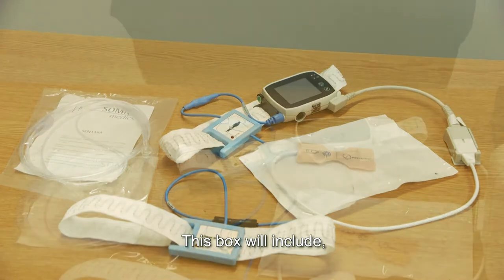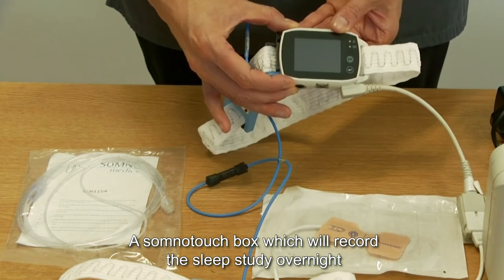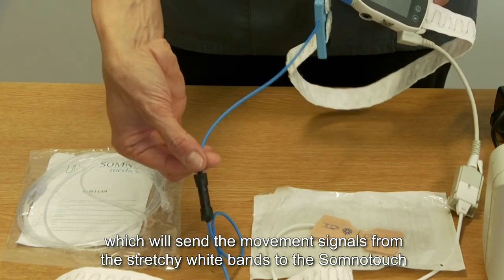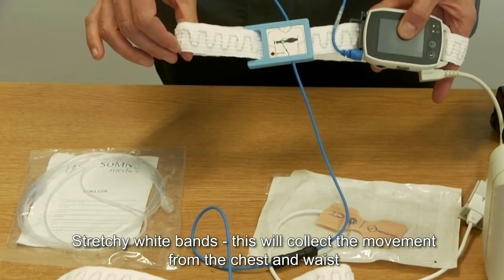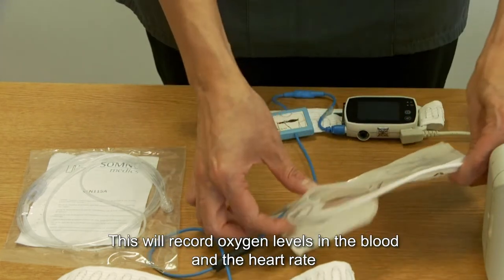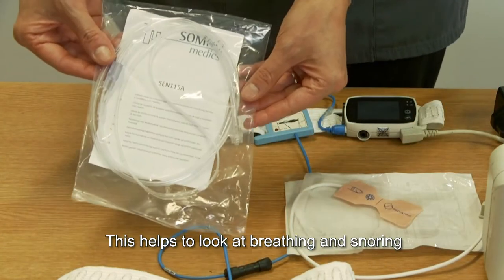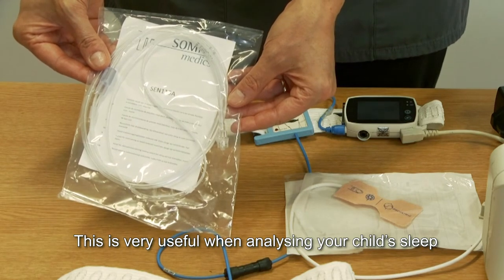This box will include a SomnoTouch box which will record the sleep study overnight, a blue band connector which will send the movement signals from the stretchy white bands to the SomnoTouch. The stretchy white bands will collect movement from the chest and the waist. A finger or toe sensor probe will record the oxygen levels in the blood and the heart rate. Nasal prongs help to look at breathing and snoring, which is very useful when analyzing your child's sleep.